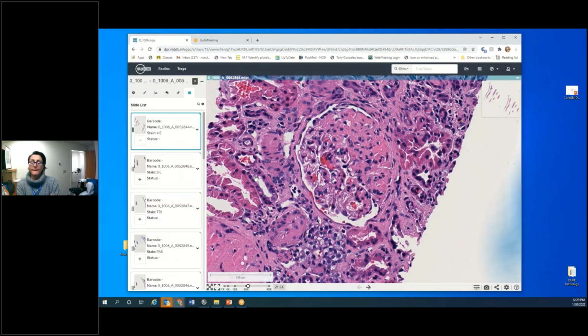Yeah, can I answer that a little bit? So when you get that, say it's a lesion of endocapillary hypercellularity, you're going to paste it into the endocapillary hypercellularity place where we used to put the level on the CRF.